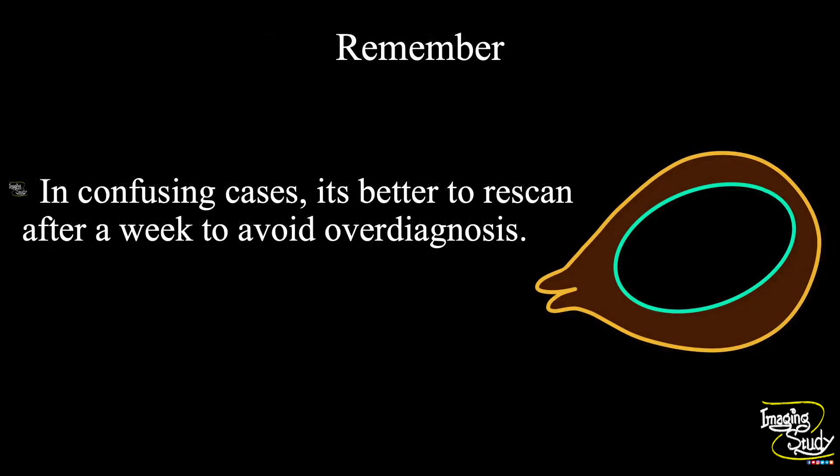The take-home message: we usually diagnose blighted ovum when the gestational sac diameter or mean sac diameter is more than 25 millimeters on transabdominal ultrasound without any embryo. If you have a very poor quality machine or if the patient is bulky, it is better to rescan the patient after a week to avoid over-diagnosis. In these cases, we sometimes wait up to 30 millimeters before calling it a blighted ovum.